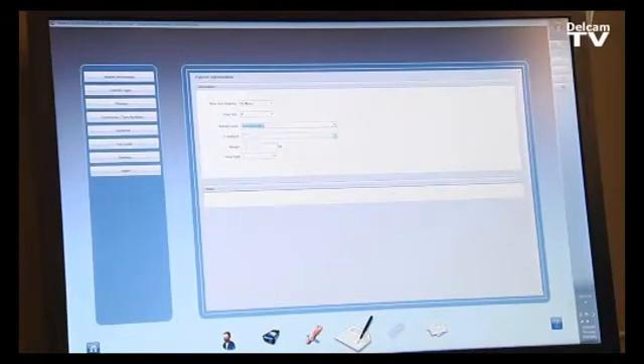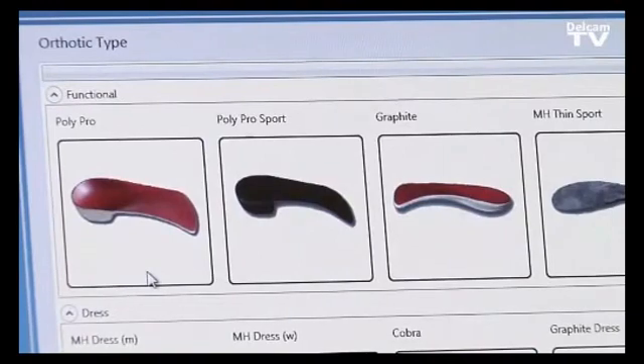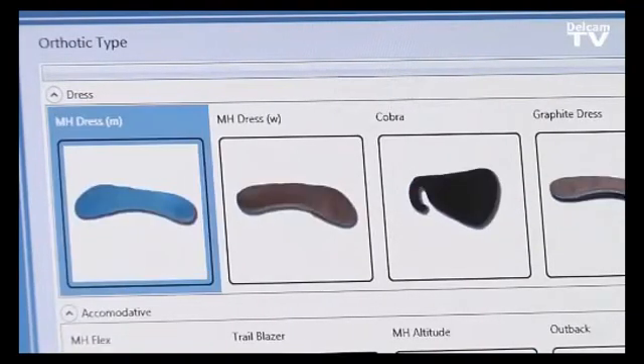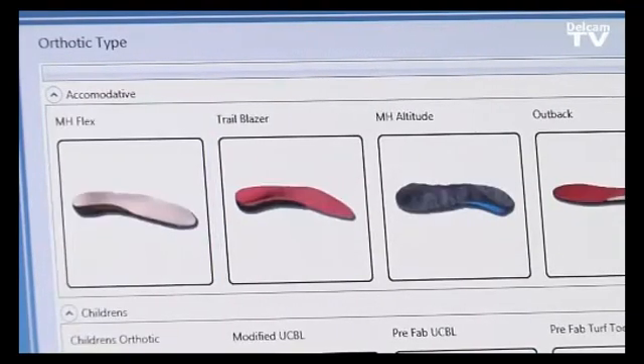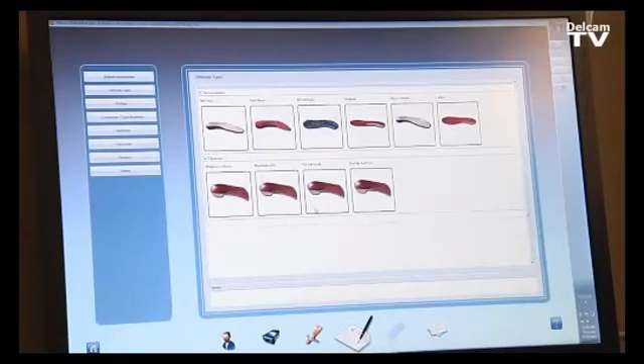We can also input the problems the patient may have, such as heel pain, forefoot pain, plantar fasciitis, and so on. Then we enter the patient's weight and shoe style depending on the manufacturer we work with. From there, we proceed to select the orthotic type — such as polypro or graphite — with quite a few different orthotic types pre-loaded in the software, all customizable.